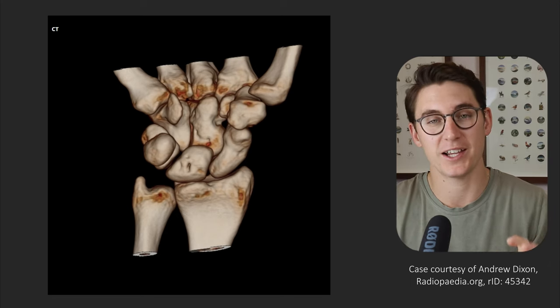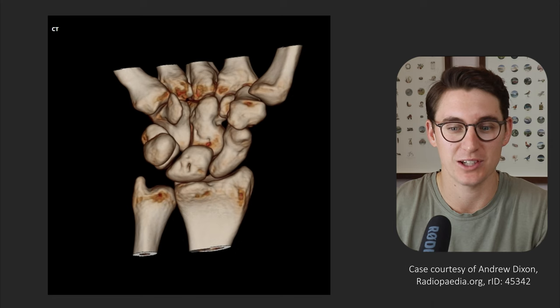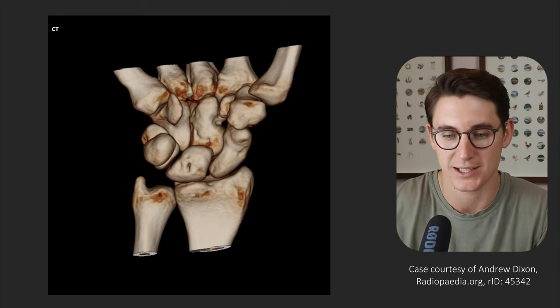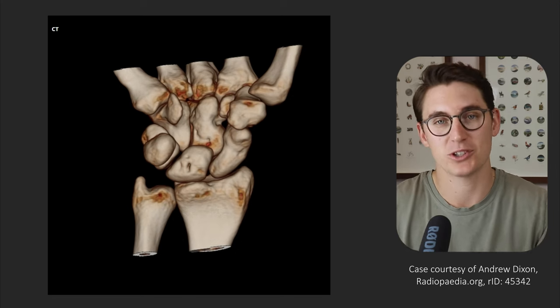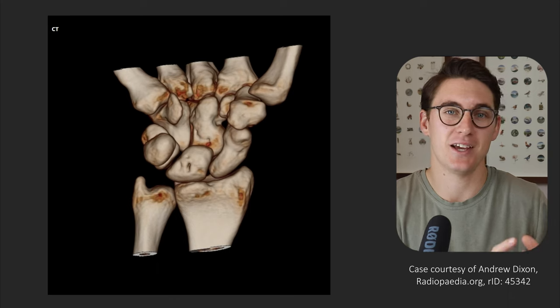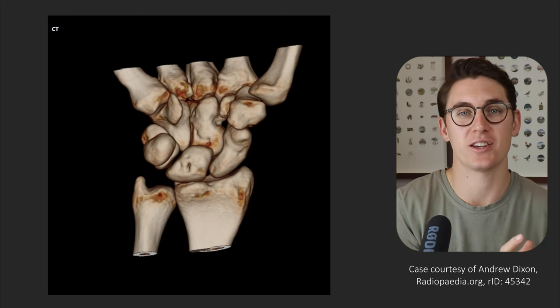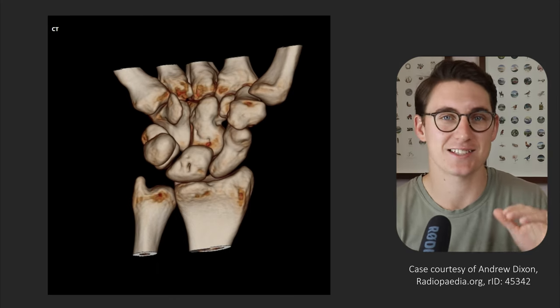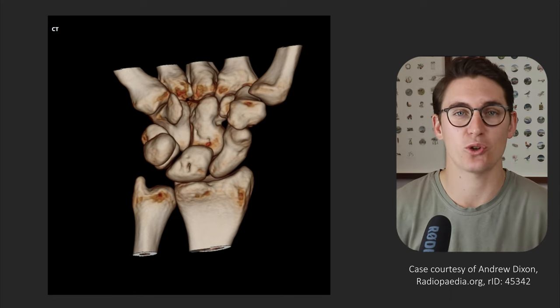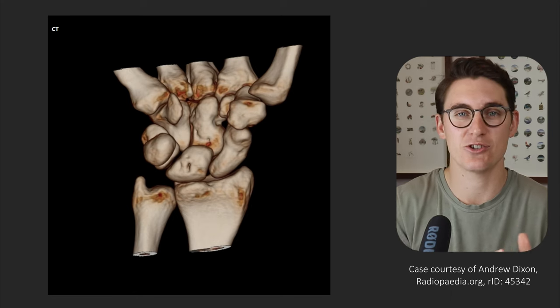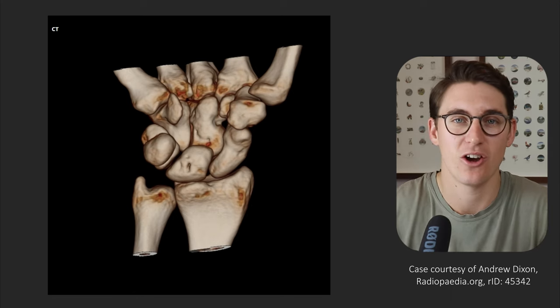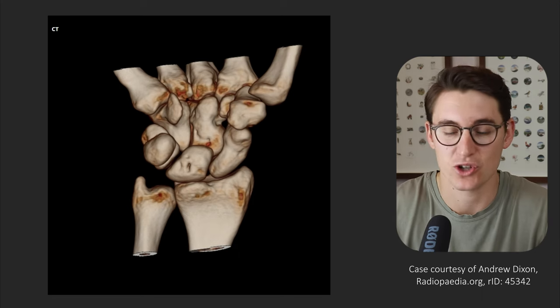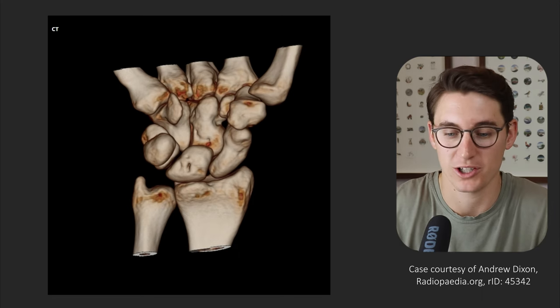A lot of people find wrist MRI anatomy extremely difficult because there's a lot of structures passing through a very small space. I want to approach this systematically today: start by looking at the bones, then identify the various different tendons that cross the wrist joint, and finish off by looking at the intrinsic and extrinsic ligaments of the wrist as well as the TFCC, the triangular fibrocartilage complex.